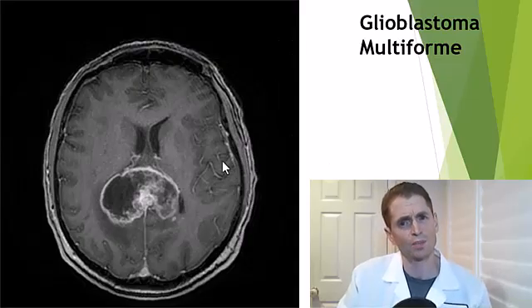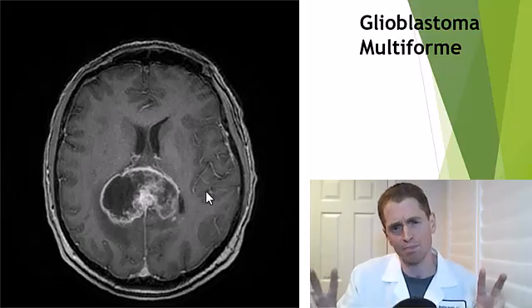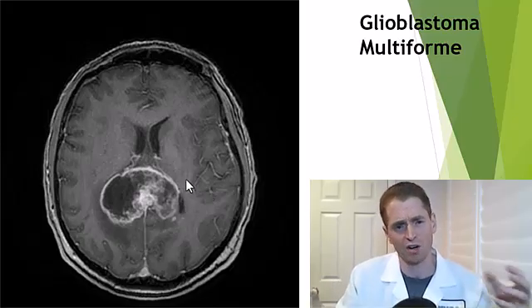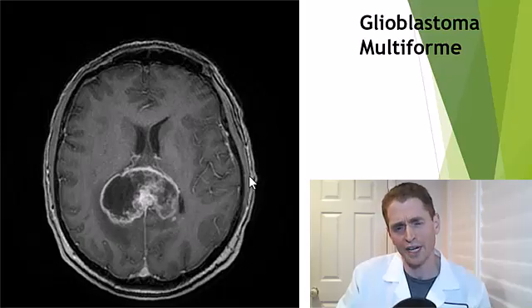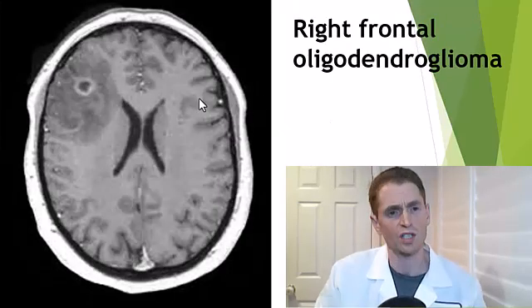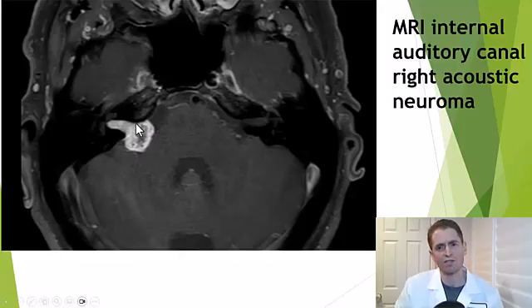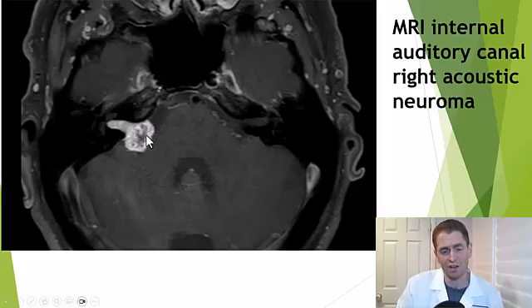This is a glioblastoma multiforme. It can invade the posterior aspect of the corpus callosum and extend to the other side of the brain, causing a butterfly effect — this could be called a butterfly tumor. It's often associated with a bad prognosis, though treatment is getting better and there are rare cases of long-term survival. Here's a right frontal oligodendroglioma with a smaller tumor and a larger area of edema or swelling. And this is a right acoustic schwannoma, a generally benign tumor that can cause hearing loss on the same side if it becomes enlarged.